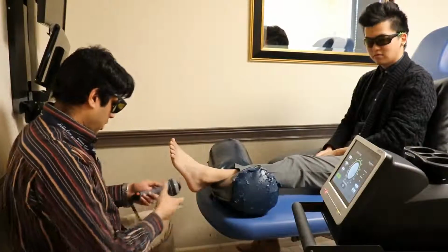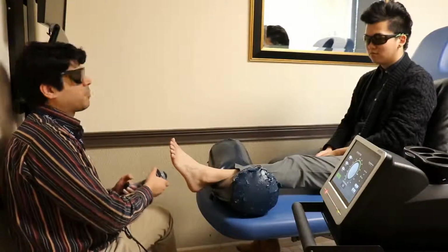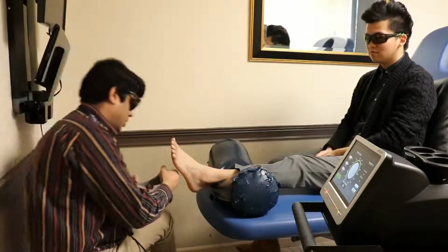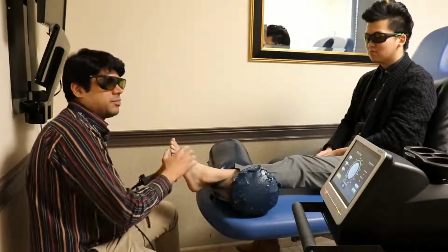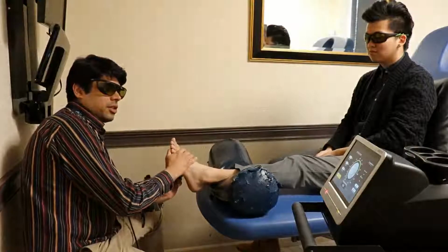Alright, ready to roll. So when I turn this on, you're going to feel it. The sensation has to be warm and soothing. That's your keyword, okay? Are you ready? So here we go. I'm just going to roll it up and down, nice and easy on his foot.